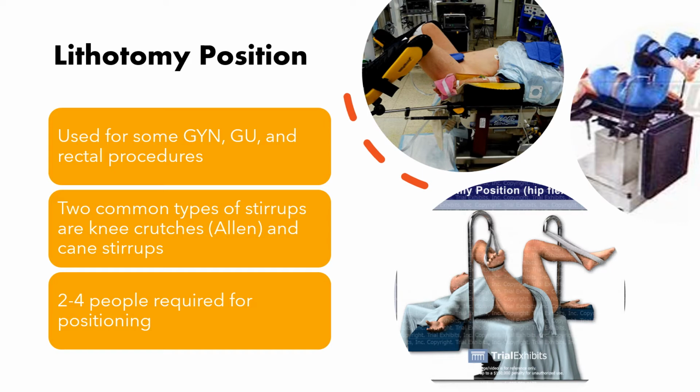Before the patient comes in, they're typically going to take that headpiece from the OR table and bring it down to the foot. So now when the patient moves over onto the bed and scoots their bottom down to the edge of the break of the table, anesthesia won't have to lean over a foot to try to intubate the patient during induction and intubation.